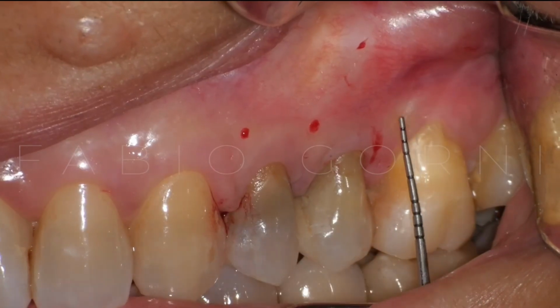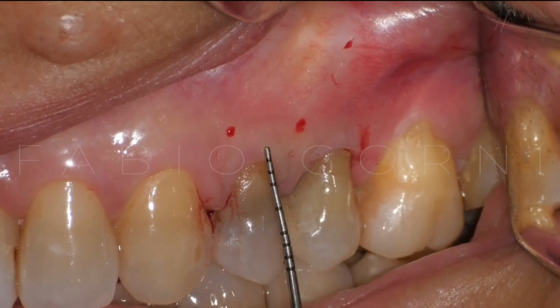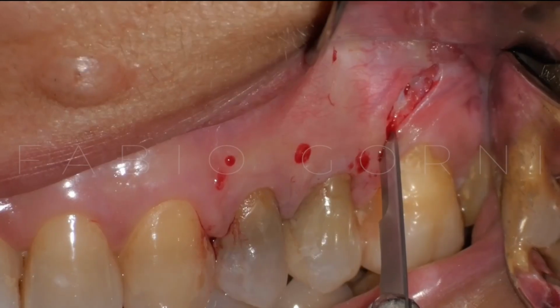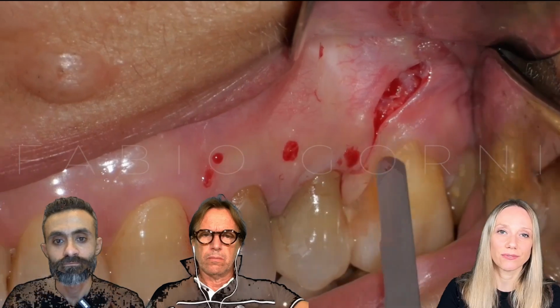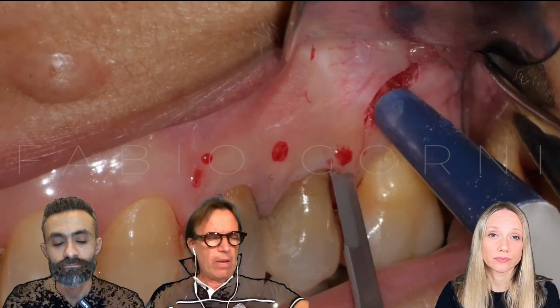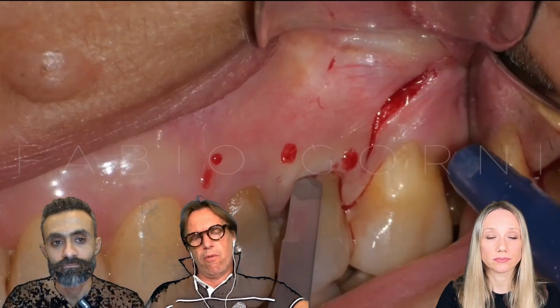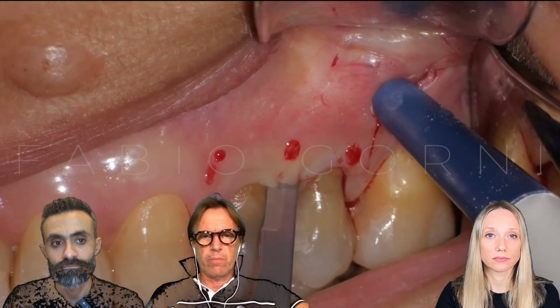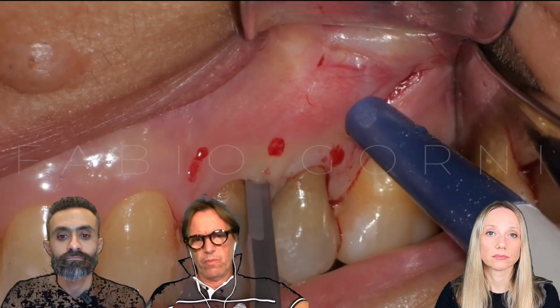So, Fabio, you spoke about incision, and we know that the design of the flap and the reflection of the flap can have an impact also on the outcome of the microsurgery. So, I would like to know from you, how do you decide the flap design and how do you perform it? So the flap design is really, really important, not only for the general success rate of the surgery, but also for the bleeding control, for example.